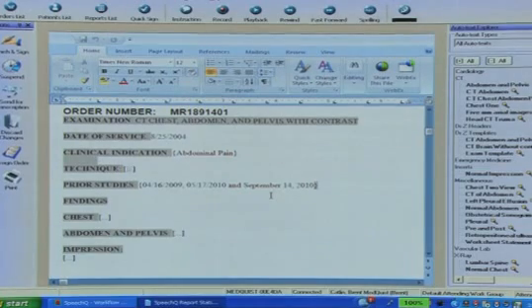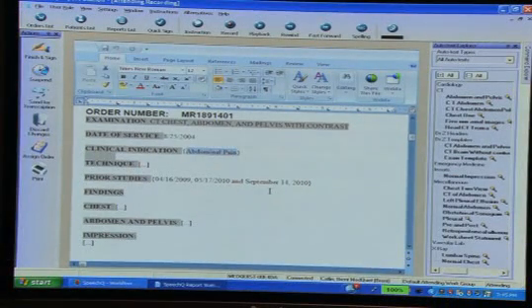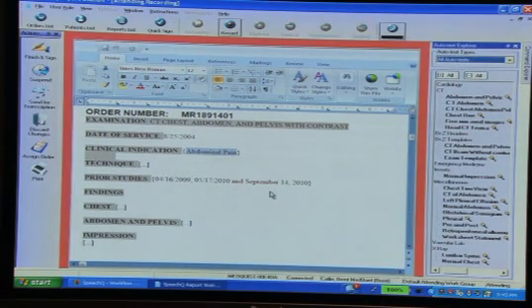Let's go back now to the beginning, abdominal pain. This is an example of a field that has default text. The default text, of course, can be changed. Severe lower abdominal pain, next field. Insert 5mm axial images, next field.